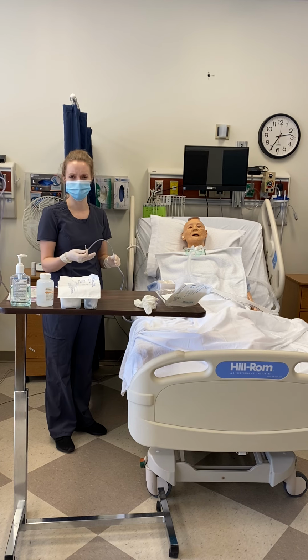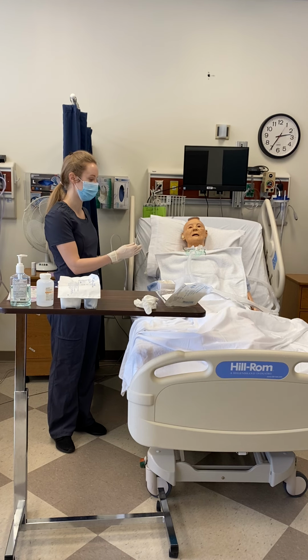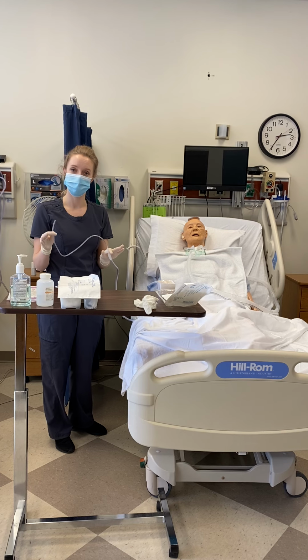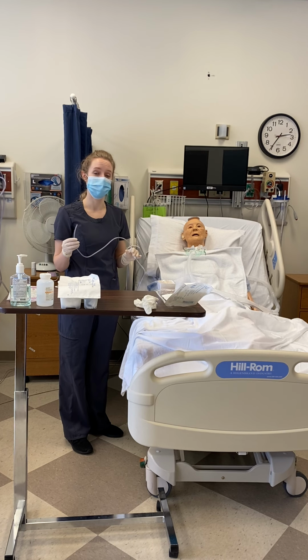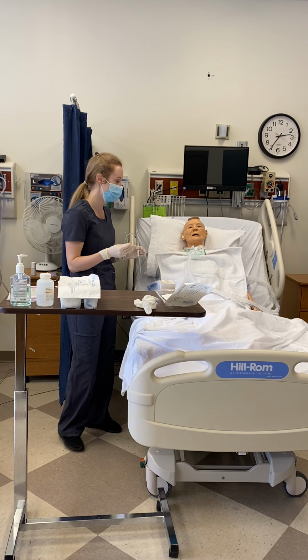that they know what's going on today, provide client privacy, hyperoxygenate them, have them sitting in semi-Fowler's with a towel, have my suctioning ready to go, respect sterile procedure when I get ready to suction, and perform a respiratory assessment to rationalize why I am suctioning him today.